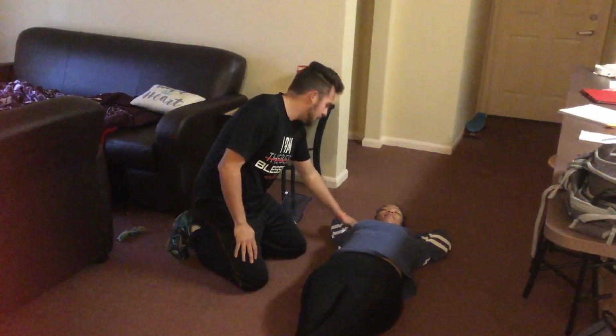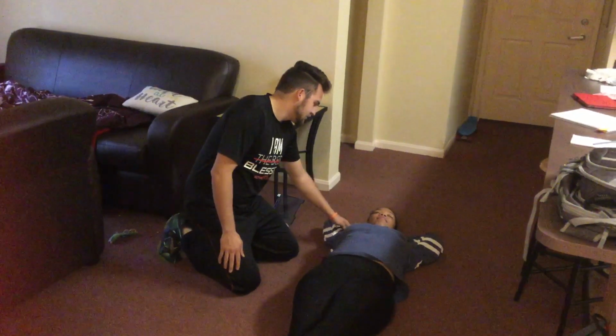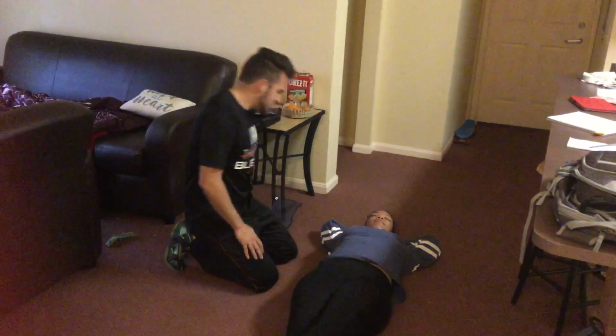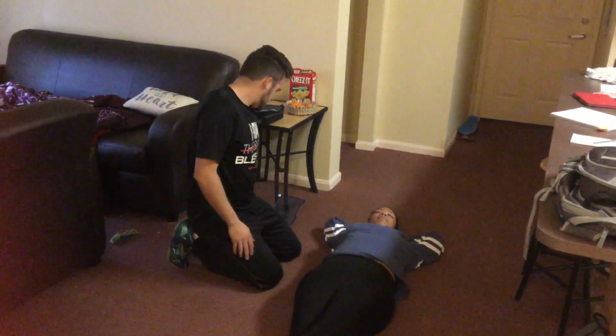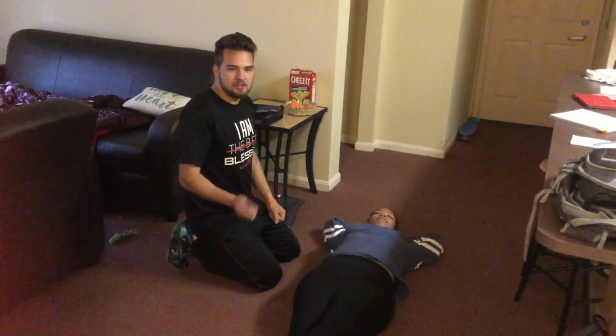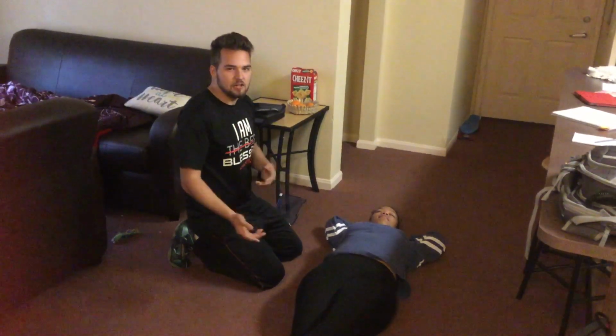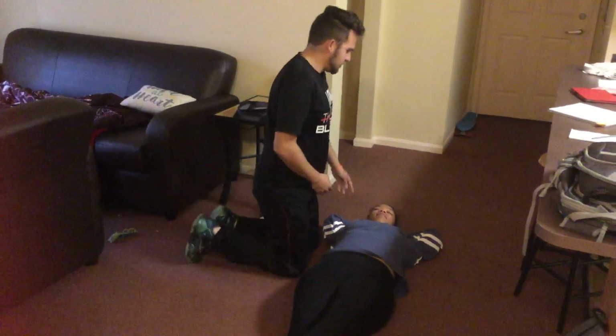So you tap them on the shoulder. Hey, obviously unconscious right here, not responding. So at that point, I would look for a bystander or some other trainer that's near you or any other admin and tell them to grab the AED and call 911. Because you'd be looking for any breathing, any pulse, any abnormalities like that.